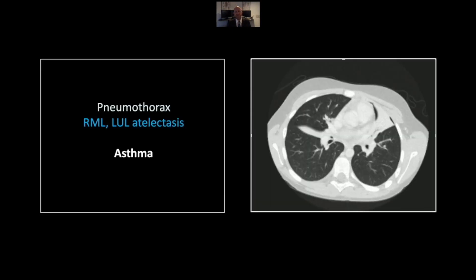Our next case is an acute asthma attack. There is frequently bronchial mucus plugging associated with asthma attacks, and as a result it will cause atelectasis of lung segments or even entire lobes. In addition, the extreme negative pleural pressures generated in air hunger can cause acute spontaneous pneumothorax. You can see there is a pneumothorax here in the left anterior hemithorax, and there is atelectasis of both the right middle lobe and the left upper lobe, near complete in fact.